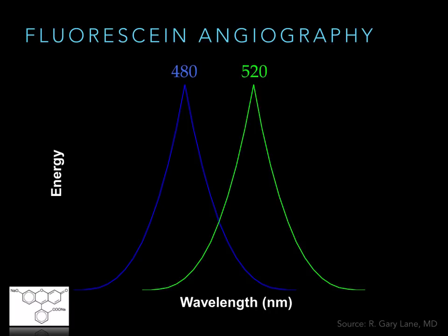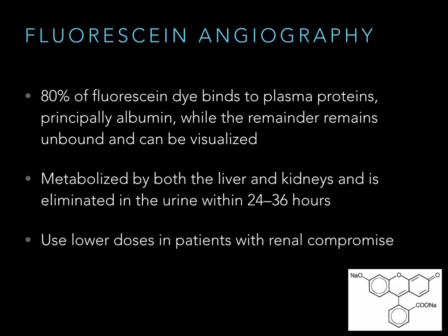That's the molecule on the bottom left. In general, we shine in blue light at 480 and it comes back at us at 520. That is not actually the way it works for some of our platforms, especially the Optos 200TX. We're not going to talk about different platforms, but just suffice to say it doesn't always work exactly like that. I'm mostly going to read off this slide.